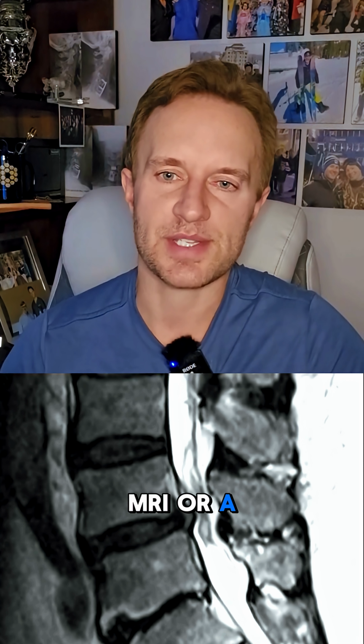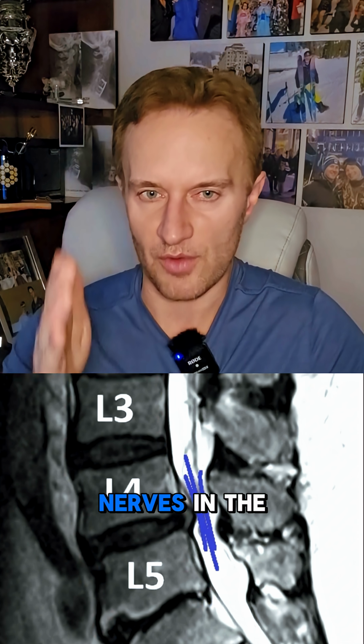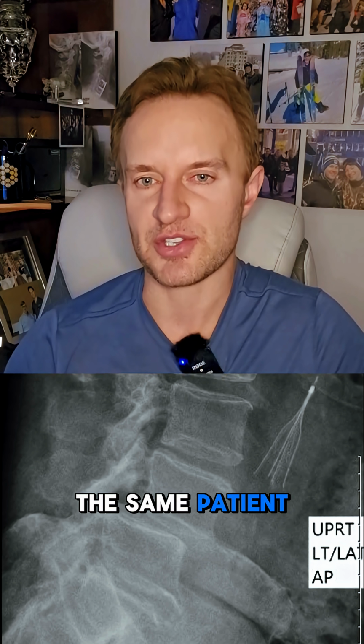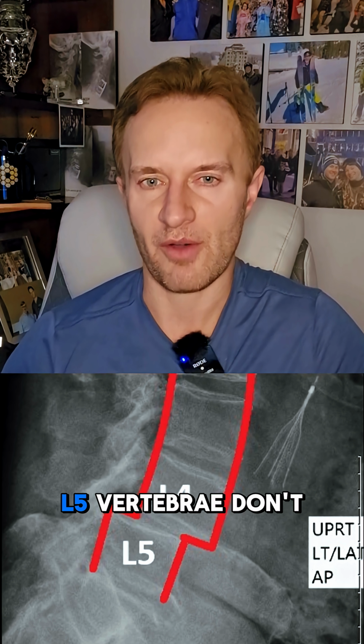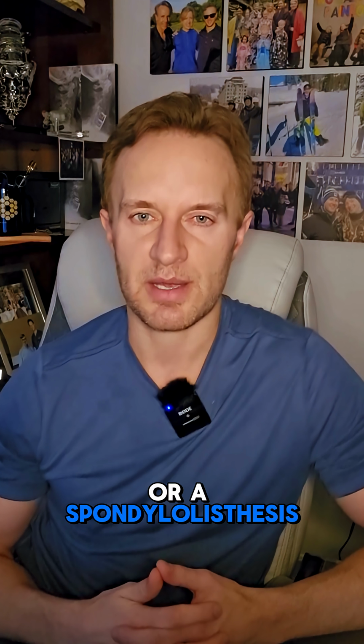This is an MRI or a side view where we can see the vertebrae are lined up nicely. There's some pinching off of the nerves in the back, but probably not enough to cause issues. Now here's an X-ray of the same patient standing up. It's obvious that the L4 and L5 vertebrae don't line up and are unstable. This is called a slip disc or a spondylolisthesis.